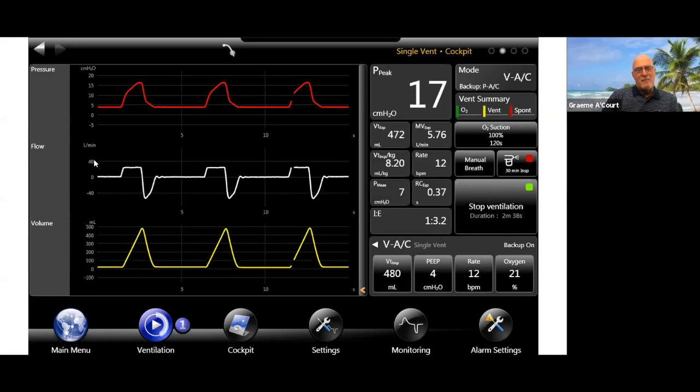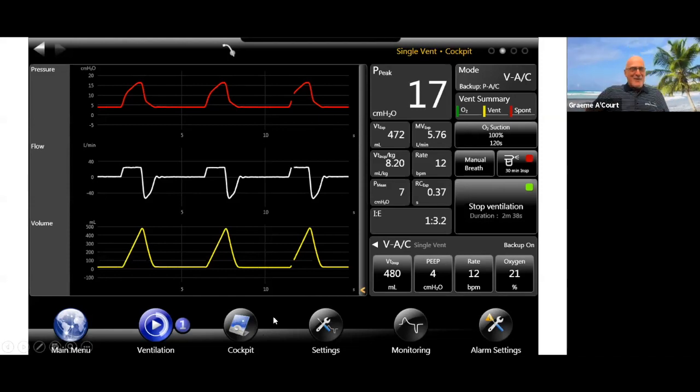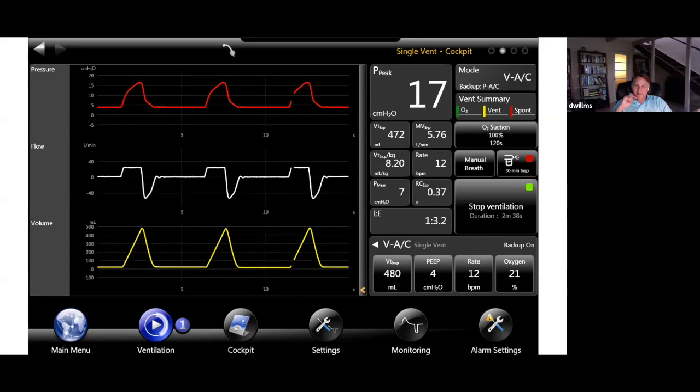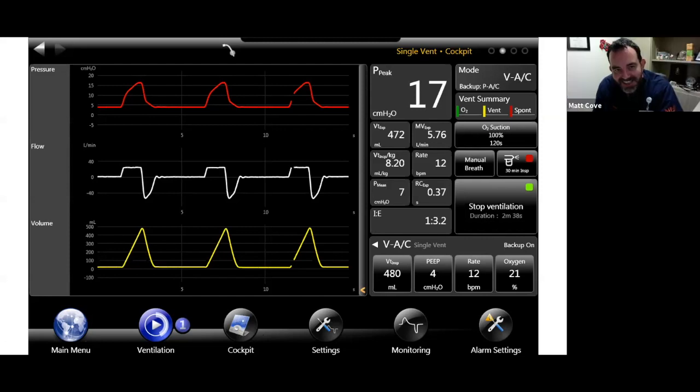Well, the question then is, Matt, and I'm sure Steve will jump in here as well. Do you actually believe what you see here? Do you actually believe it's accurate? I can see Steve smiling like he knows the answer like me. I know the answer has to be no. Very good. Well, that's probably the correct answer. That seems like that must be the answer, but yes, I do believe it. I put a lot of stock in what I see. Should I not? No. I guess the answer is no, but we practice as though it's yes.